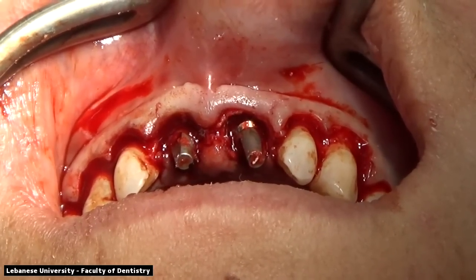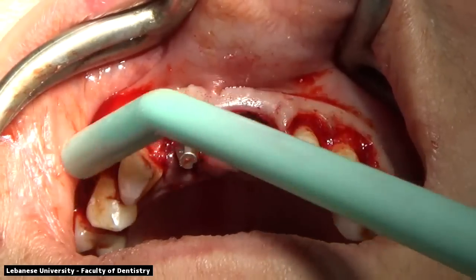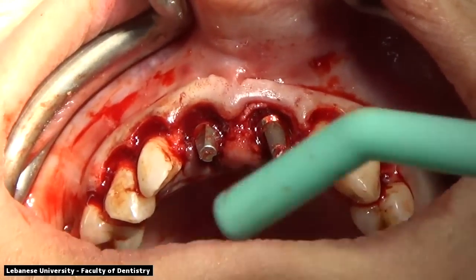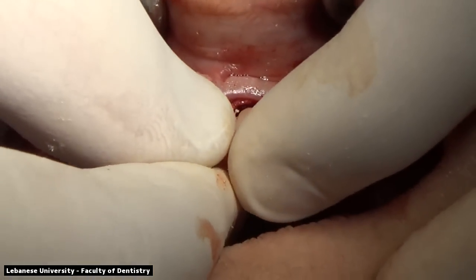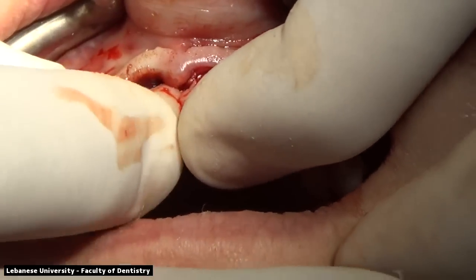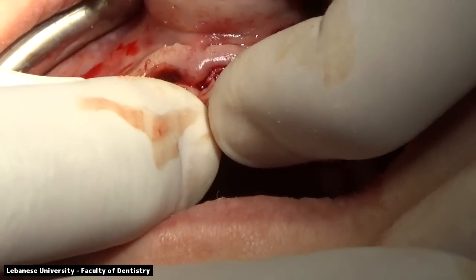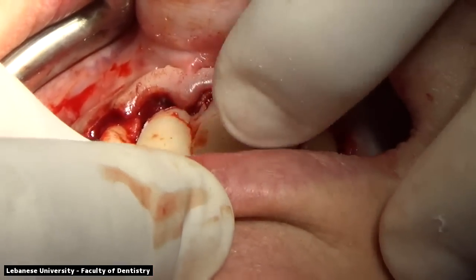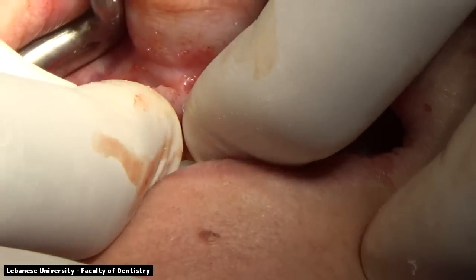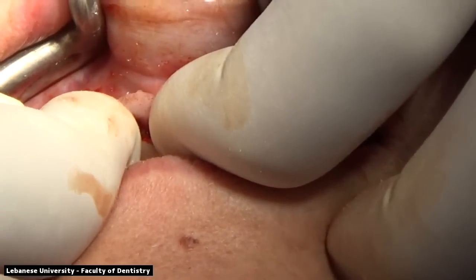Need to make sure that the contact point in between the two centrals is slightly open so that there is no accumulation of plaque and that the papillas in between the two central incisors have some space for them to breathe and that there is no violation of the biologic width at the side. The extension of the provisional restoration will be at the margin of the abutments on both the right and the left side.